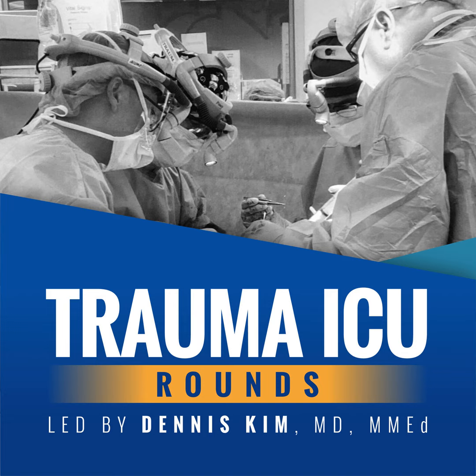Now, as you can imagine, there are several issues or problems with assessing a MIP or a NIF. Number one, your patient has to be awake, alert, cooperative. Number two, they have to understand what you're asking them to do. And number three, it's not really that helpful in all patients.